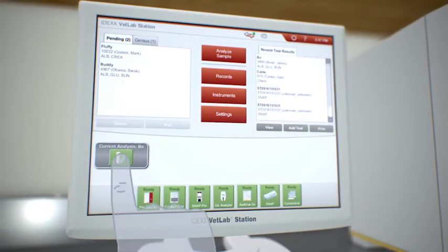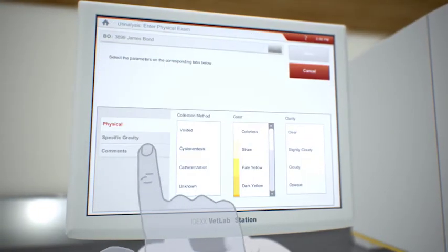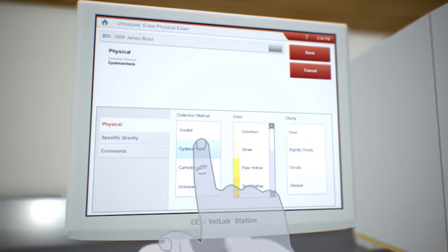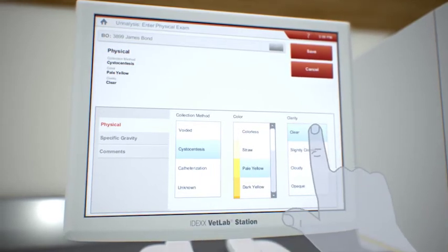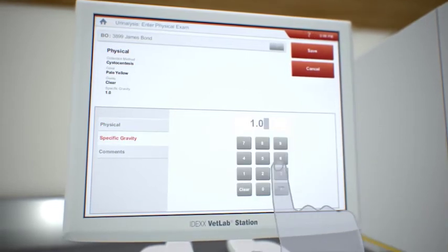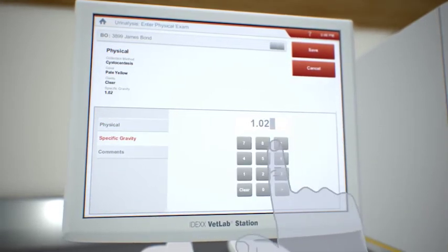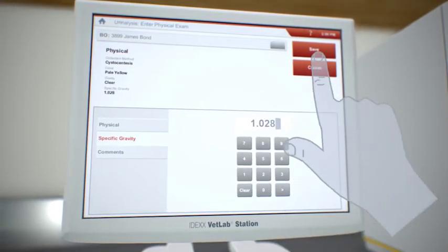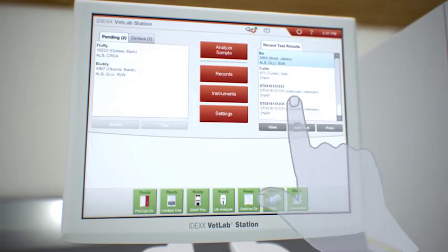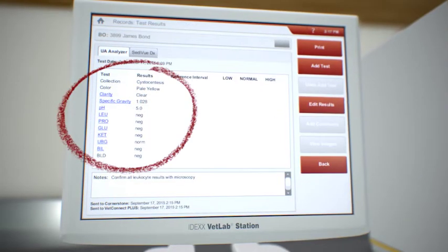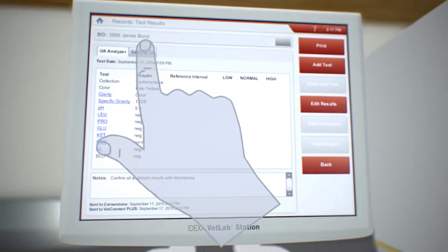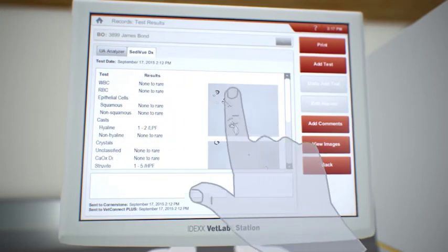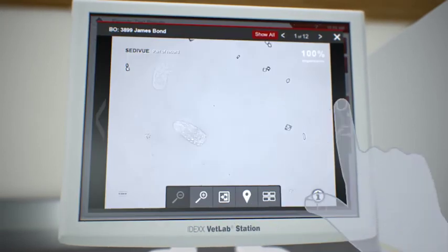The VetLab Station software allows you to add the physical findings to the patient record so all the results from your complete urine analysis are captured in one place. You can view your results on the VetLab Station, including the images captured by SetiView.